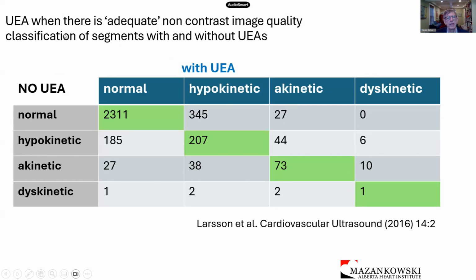This is also a study of almost 200 patients where before stress echocardiography comparing the reading of non-enhanced images with the readings after injection of the ultrasound enhancing agent. And just look at the line of the normal findings. There are a significant number of patients where the clinical assessment changes from normal to hypokinetic or even akinetic.